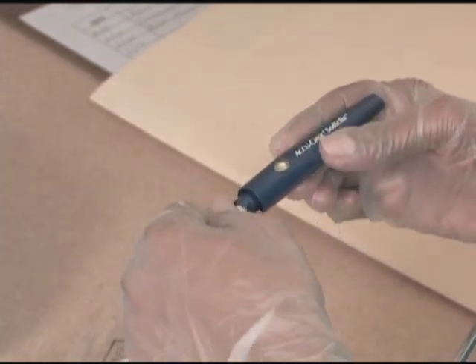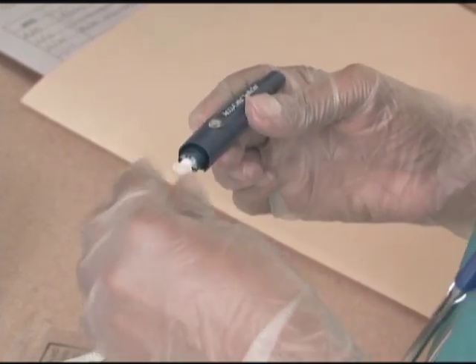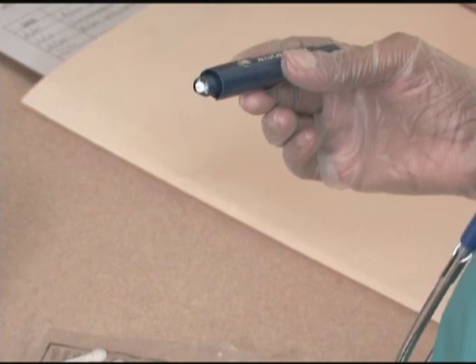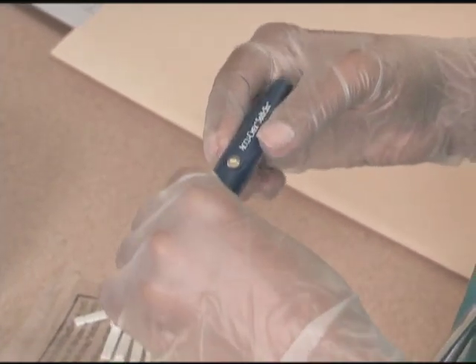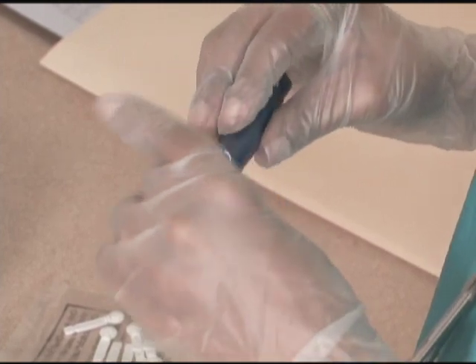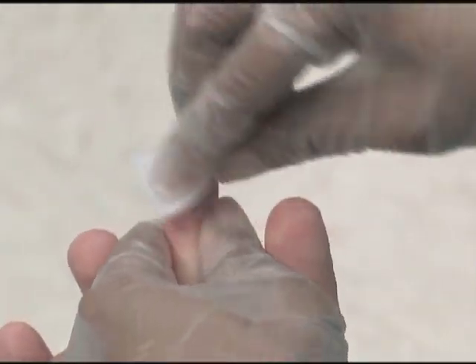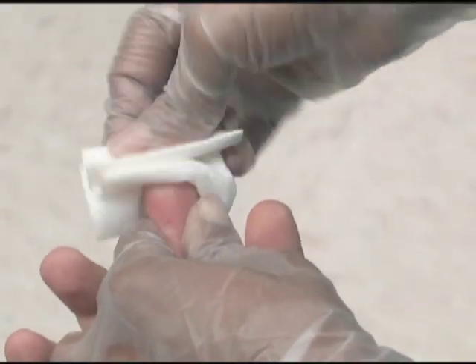Assemble the supplied skin puncture device. Obtain a capillary blood specimen from the patient following standard procedure, as detailed in other videos in this series. Venous or arterial specimens may also be used.